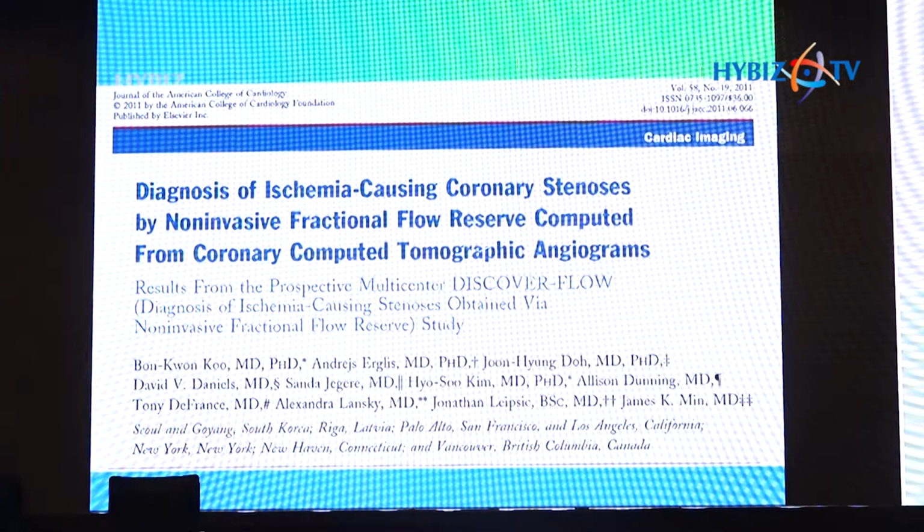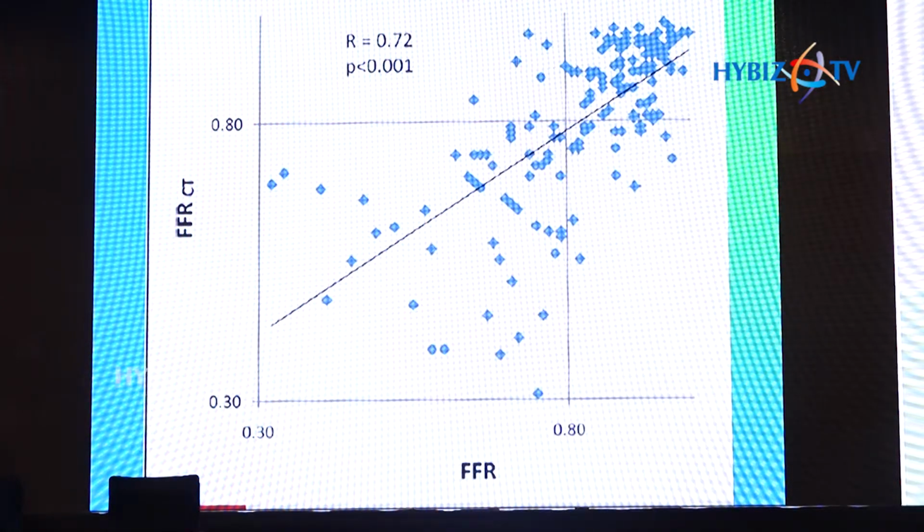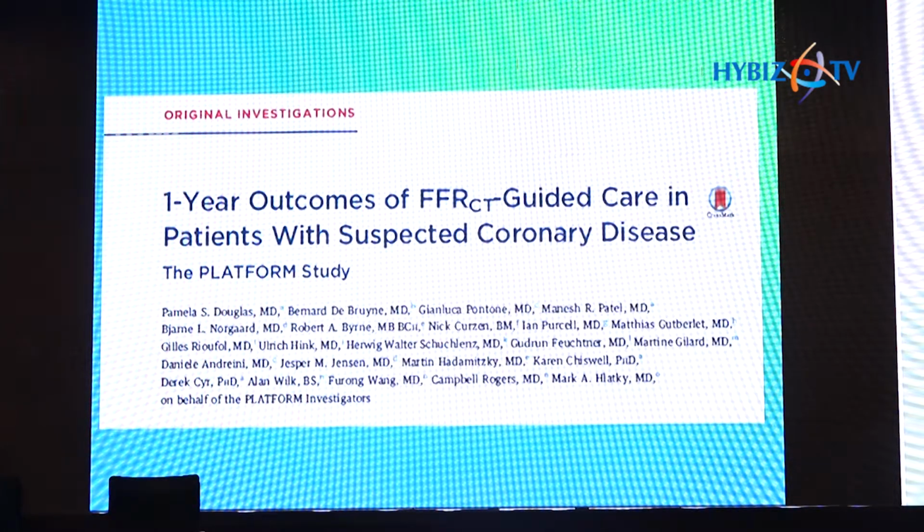The next on the world stage was the DISCOVER-FLOW trial, and this is a trial which put CT again in front stage by showing that CT FFR, which is a non-invasive way of looking at it, was almost, if you look at this curve, in tandem with invasive FFR. However, there are some outliers here where the CT FFR will not pick them up and the invasive FFR will pick them up. But for most cases, CT FFR would be able to discriminate lesions which are important.